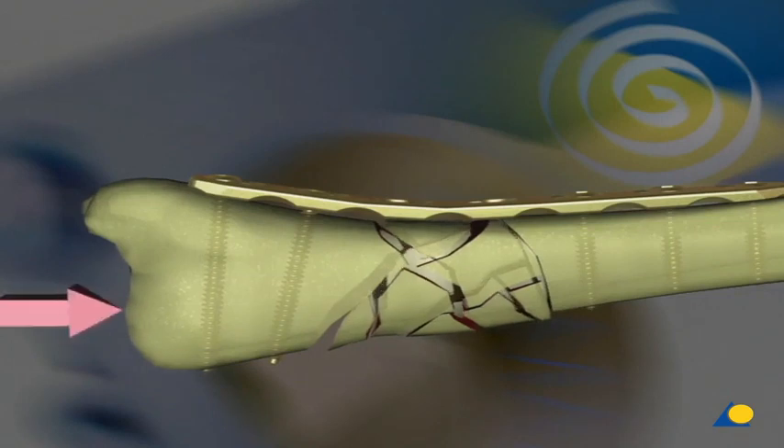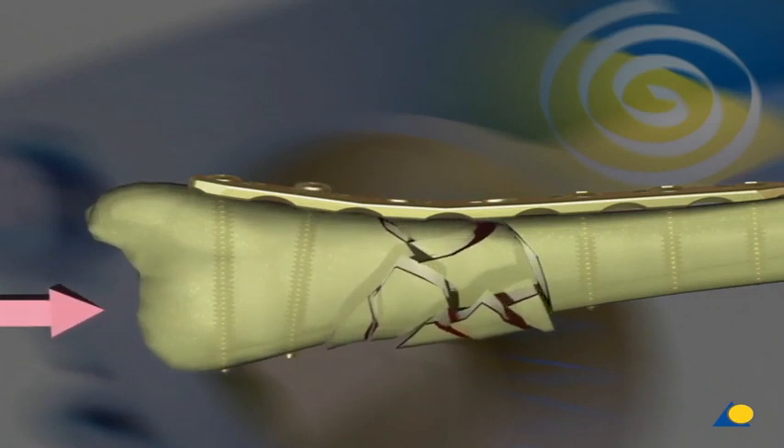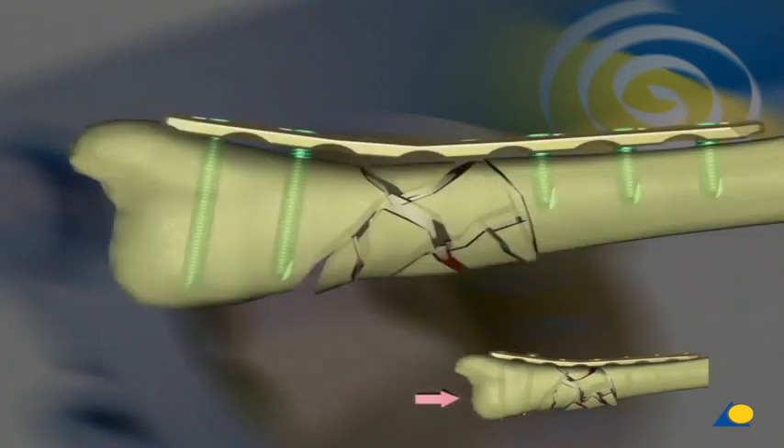Loss of secondary reduction. In the absence of supporting bone, a secondary displacement of a fracture stabilized with the plate and standard screws can occur under cyclic load once the absolute compression between the plate and the bone is missing. Fixation of the plate with locking head screws in the sense of an internal fixator can prevent this loss of secondary reduction.